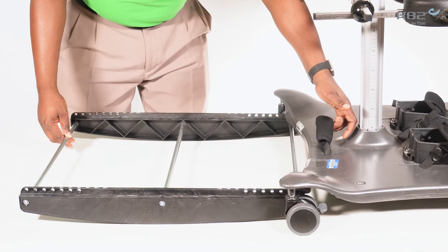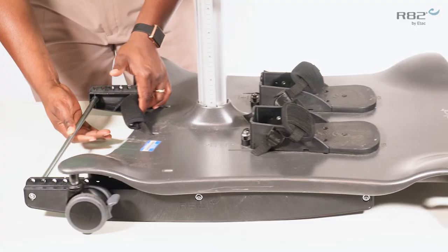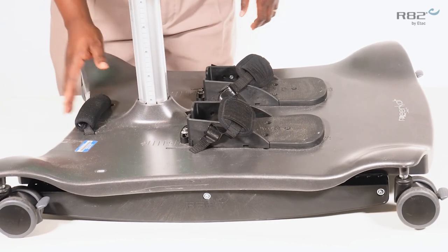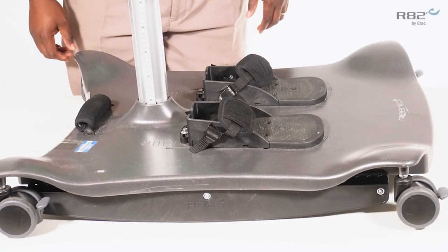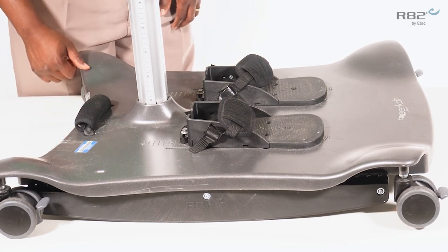Pull up on the handle and pull the Meerkat onto the base plate. When you release the handle, you will hear an audible click, indicating the rocker is locked into position.